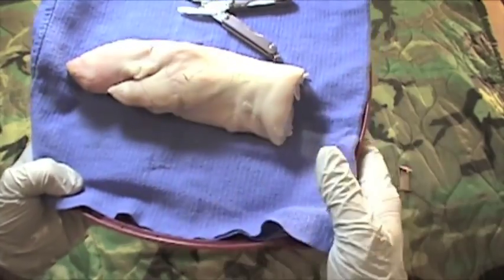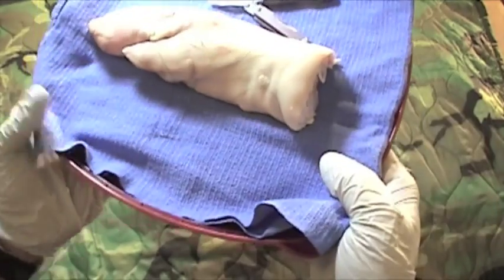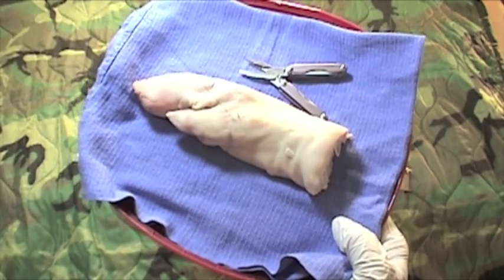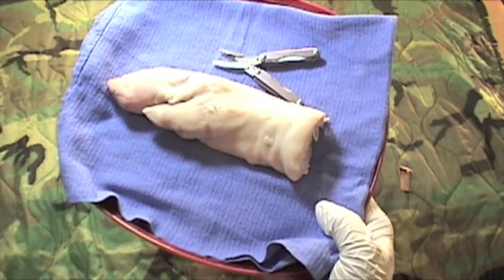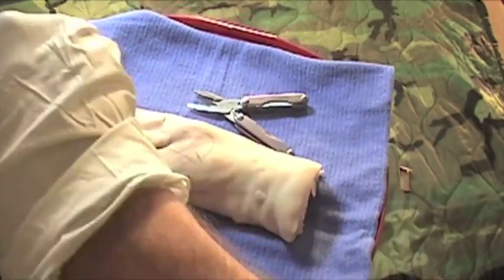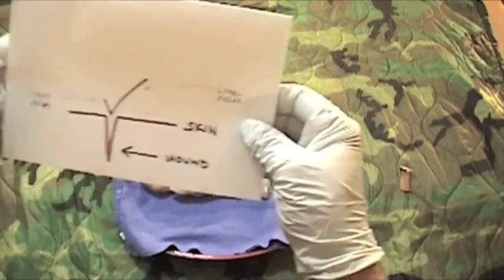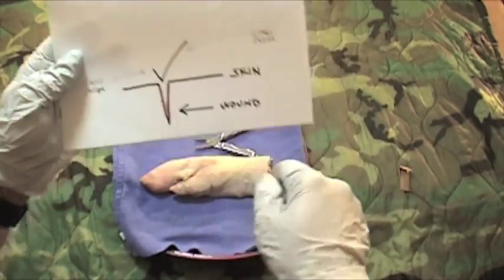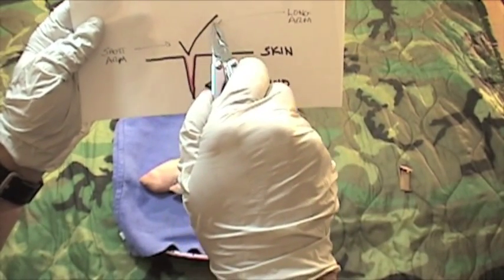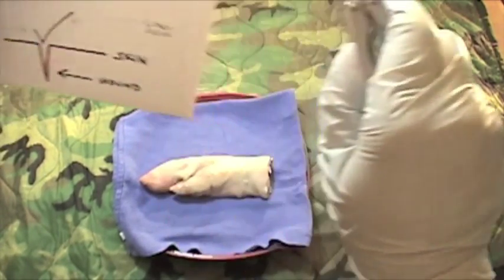Now let's look at what we have. We've got our wound — we've entered on one side and exited through the other side. We have the needle on what I'm going to call the long arm, and over here we've got the short arm. We're going to take our needle driver, put it in between, wrap the long arm around the needle driver, and then grab the short arm to tie a knot.